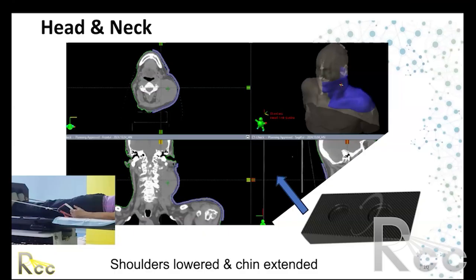I'm asking about this one because sometimes when you work in virtual, you cannot do the same in the treatment area. So there may be some air under this one or between the skin and the bolus. Also, I'm asking about how to put the bolus over the mask. Is it possible or not? Okay, and so this is a very good point, and the issue of air gaps was raised. This virtual bolus is really perfect or ideal in the sense that it perfectly conforms to the patient. Whereas in reality, with physical bolus, even when it's placed at SIM, there could be air gaps, which are undesirable.